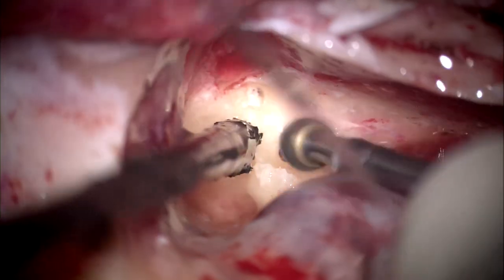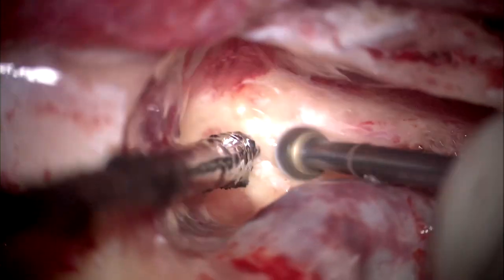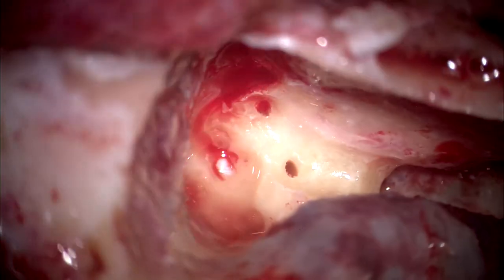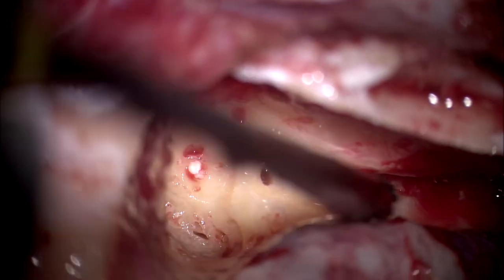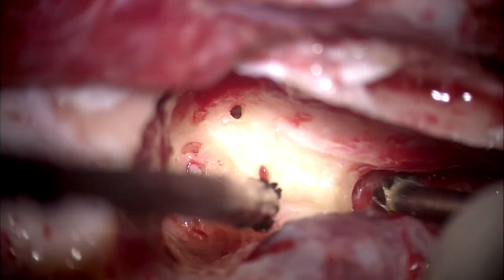See, that is your facial nerve above. This facial nerve is your anterosuperior limit. See this? We have to remove all bone underneath it. Sir, can we see the subarcuate artery here? What? Subarcuate artery. Sir, the arcuate artery is here. See this here, this one? In between the canals.